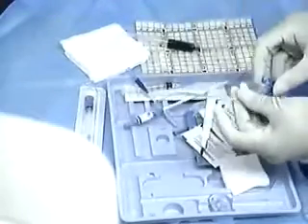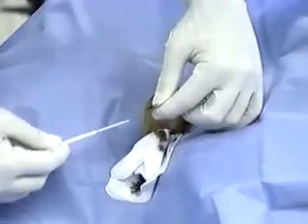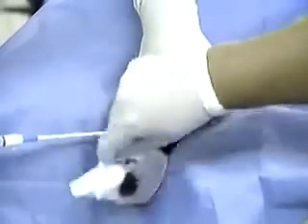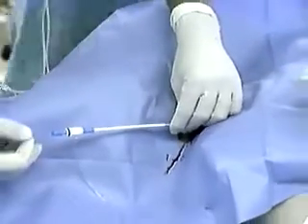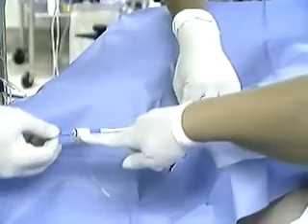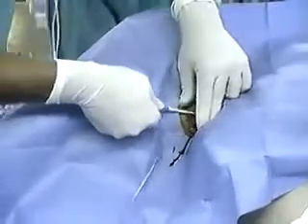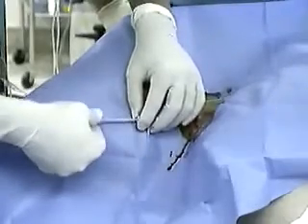Note the side port through which you can infuse IV fluids. Thread the wire through the lumen of the dilator and advance the dilator and introducer together over the wire. Note that the operator never loses sight of the guide wire. The dilator is advanced with a slight twisting motion, and once in place, the dilator and guide wire are removed, leaving the introducer sheath as the only connection to the intravascular space.